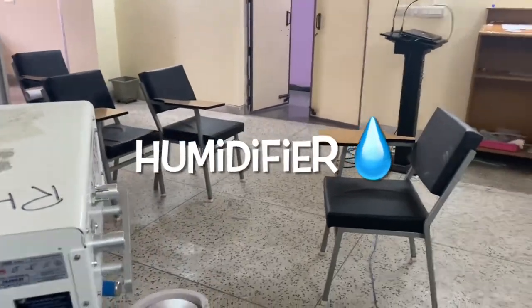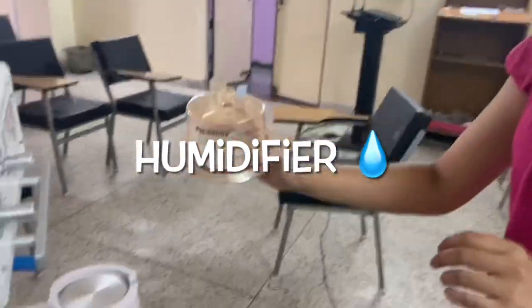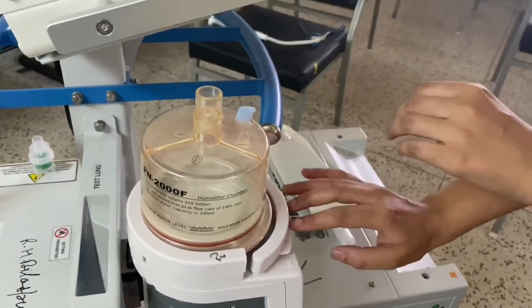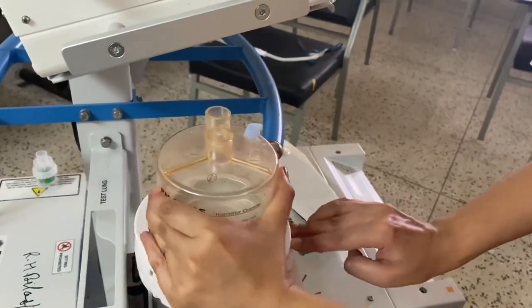Now we will be attaching the humidifier. It slides into place with just a little push and can be removed by pressing the portion in the front.